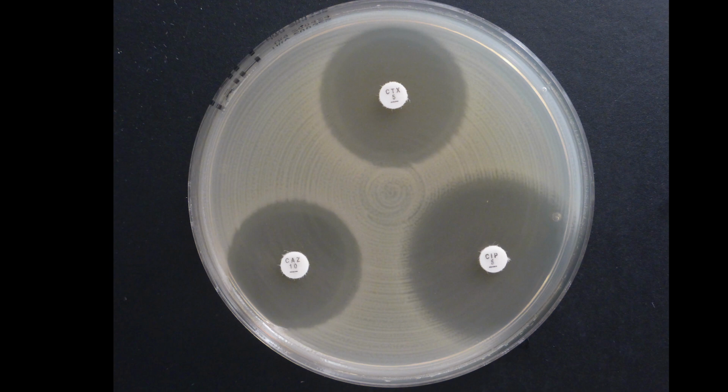So this could be part of the theoretical background, and you have access to the disk diffusion reading guide, which contains both the more general reading instructions and how to handle colonies within zones if there are no specific instructions on that, how to deal with hemolysis and swarming, etc. And then in the end we also have the specific reading instructions that apply to specific organism-agent combinations.